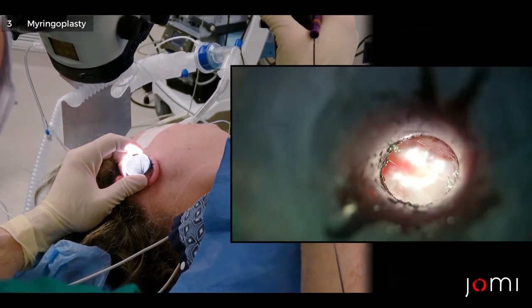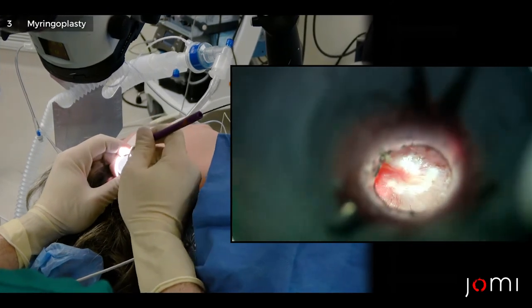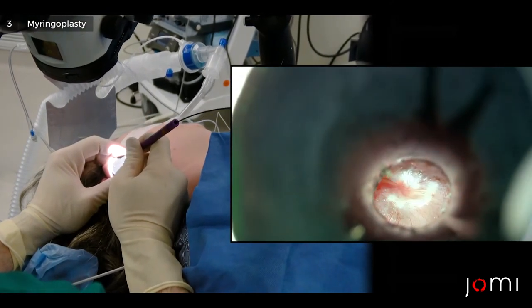Now I'm going to get the back part of the eardrum, which was a little less retracted but still retracted nonetheless. Laser on.